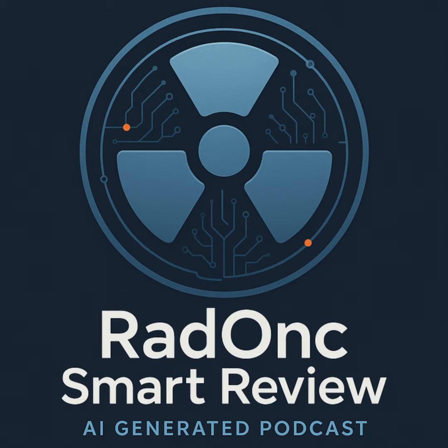They achieve this seamless communication by speaking a universal standard language called DICOM. DICOM, D-I-C-O-M, and it stands for? Digital Imaging and Communications in Medicine. Okay. It's more than just a file format, you see. It's a whole protocol for handling, storing, printing, and transmitting medical imaging information. Think of it like the Esperanto for medical images and all the data that goes with them. It's a universal language. Precisely. Without DICOM, trying to get equipment from vendor A to talk to software from vendor B, it would be a nightmare. Probably impossible, really.